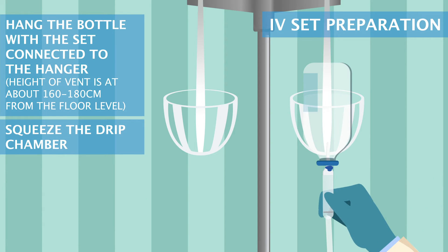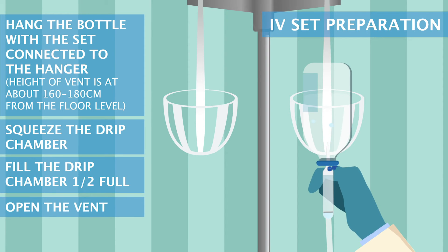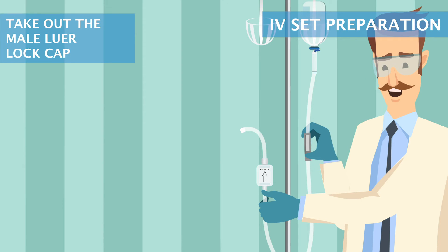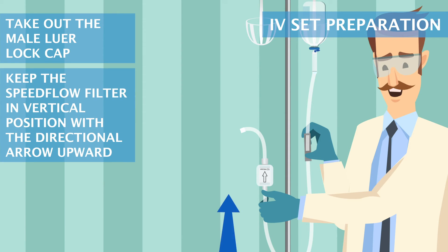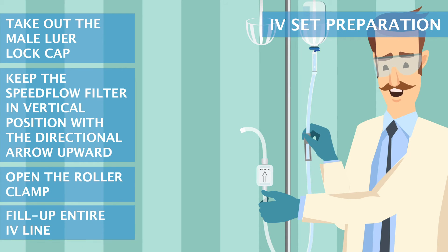Squeeze the drip chamber to fill it one half full. Open the vent. You can follow a similar procedure when using a bag. Take out the male luer lock cap. Keep the Speedflow filter in a vertical position with the directional arrow upward. Open the roller clamp and fill up the entire IV line.